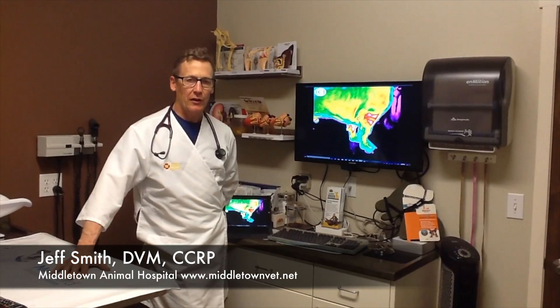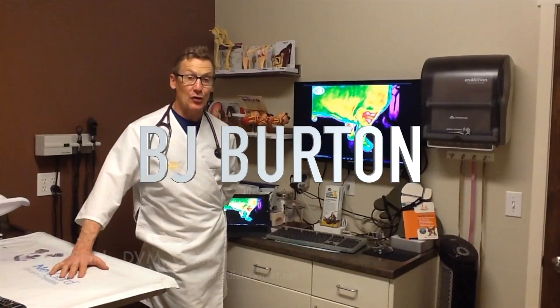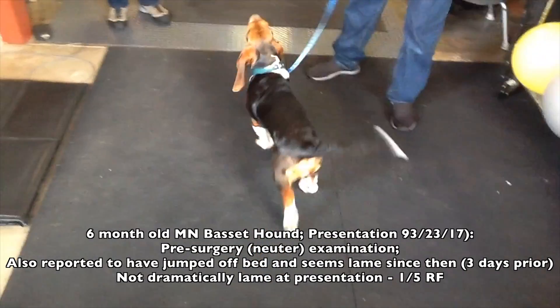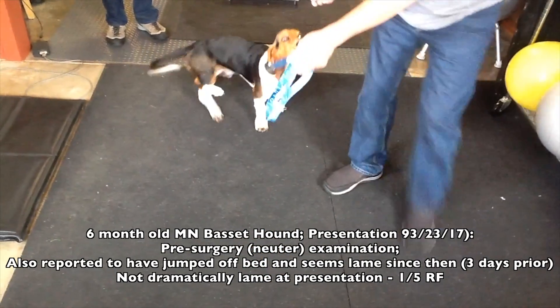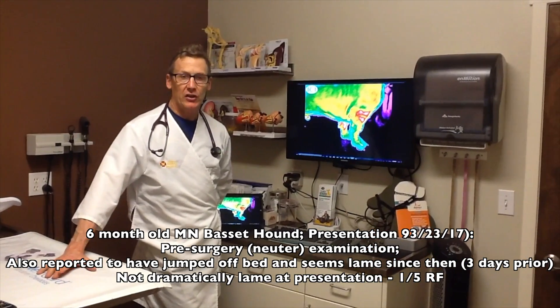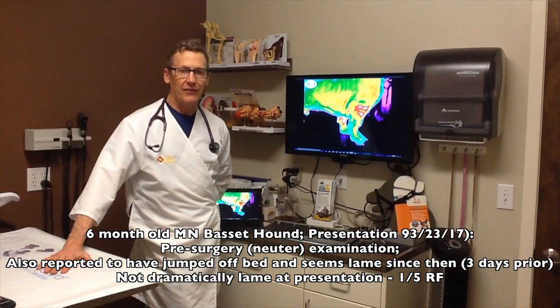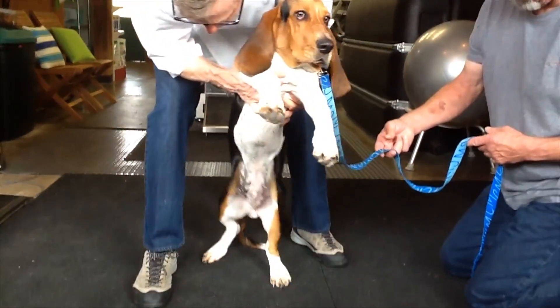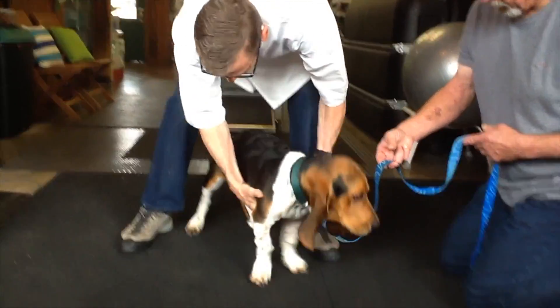I'm Jeff Smith from Middletown Animal Hospital, and this is the case of B.J. It was an interesting case because it was a young dog that was lame a little bit off in the front end and obviously not demonstrating which joint was painful.